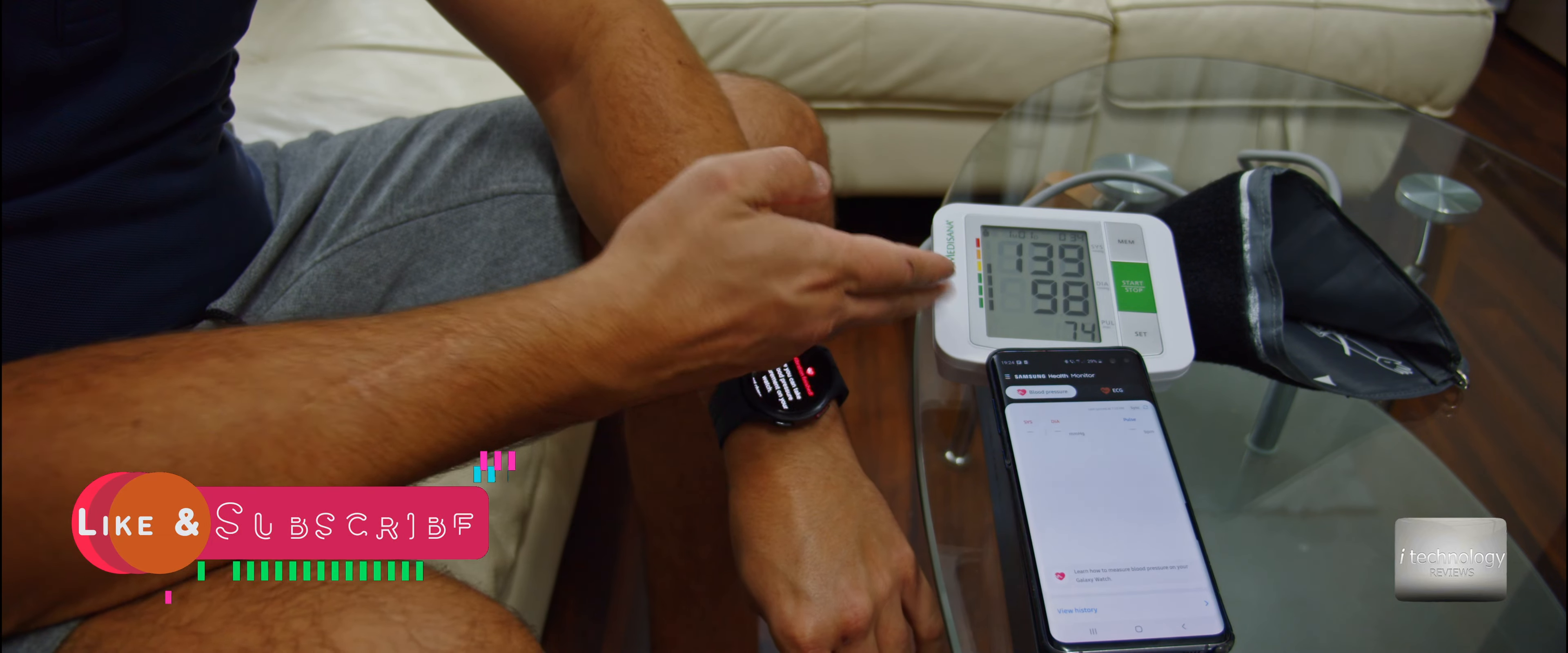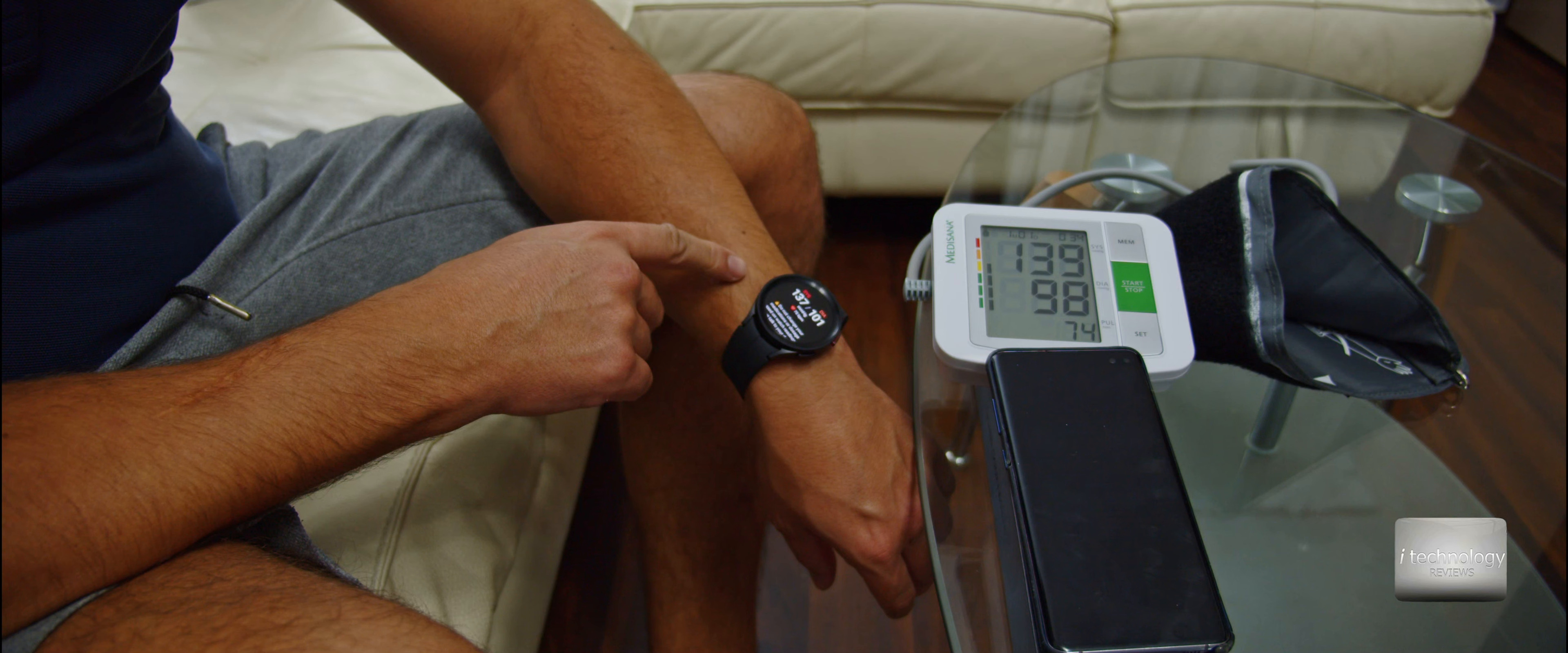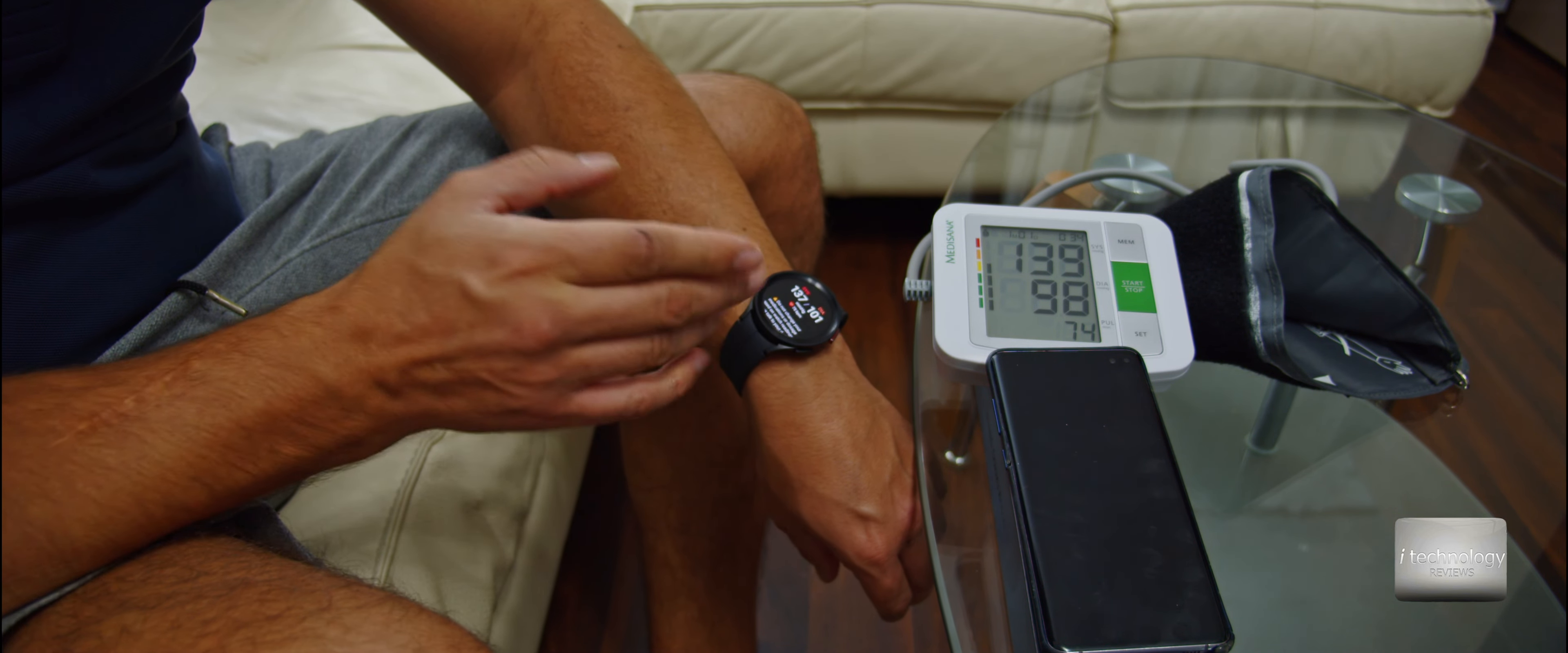Memorize these numbers and let's see if the watch will measure the blood pressure standalone now. Look guys, it's accurate. 137 by 101. This is how you will calibrate your smartwatch good and accurately.